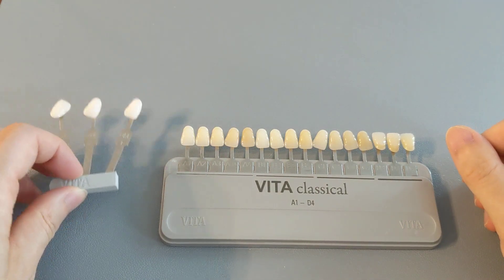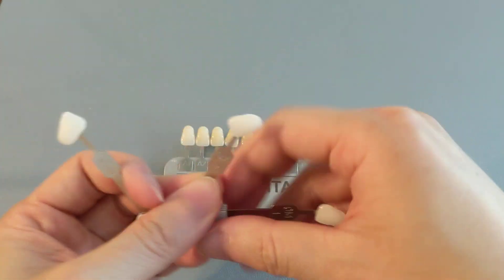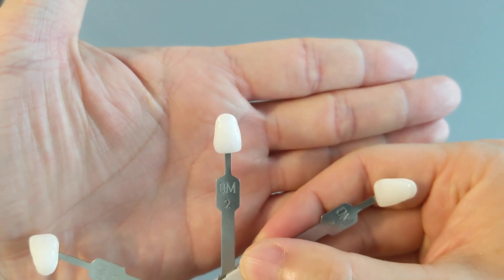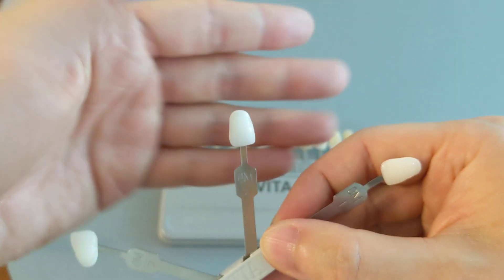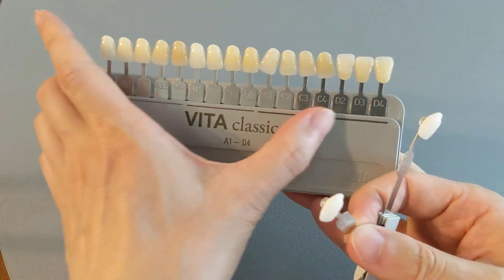This video is to show you what the 0M2 tooth color looks like. So here we have the 0M2 right there. It is fairly white — very, very white. It is the second whitest bleach tooth shade.